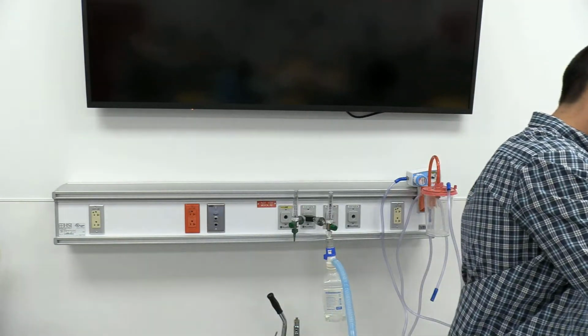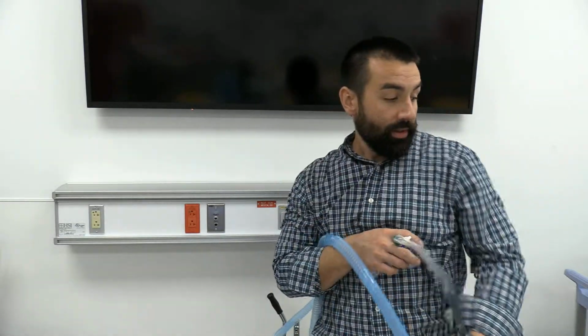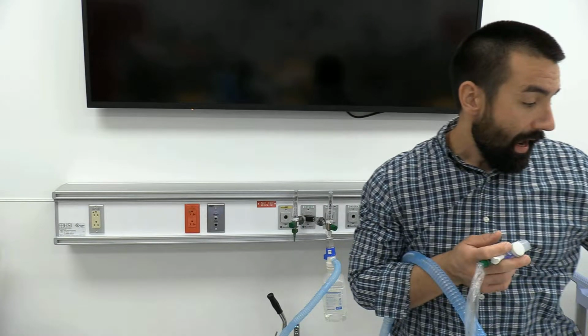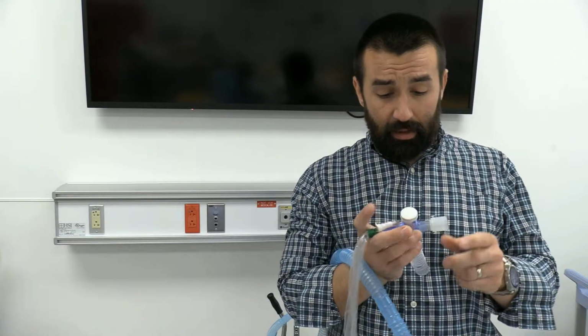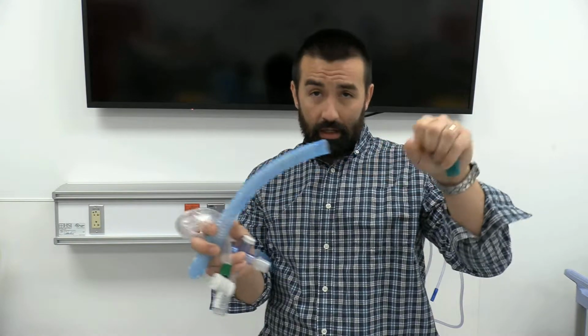So let's say we got a patient with a ton of secretions. We can use something called a Briggs adapter or T-piece. So I'll be real with you, we don't really commonly use the Briggs adapter a whole lot anymore, okay? The Briggs adapter and the T-piece are for use for artificial airways. So you either got an endotracheal tube or more commonly a tracheostomy tube. So it's talking about standard diameters. This tubing is 22 millimeters internal, and it hooks up on all the things we've been talking about.